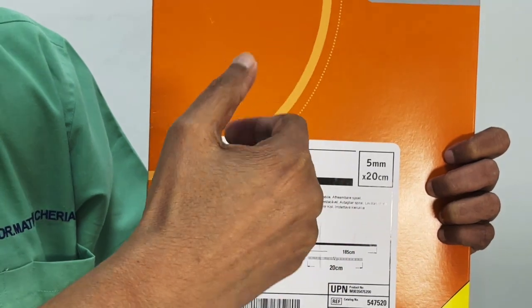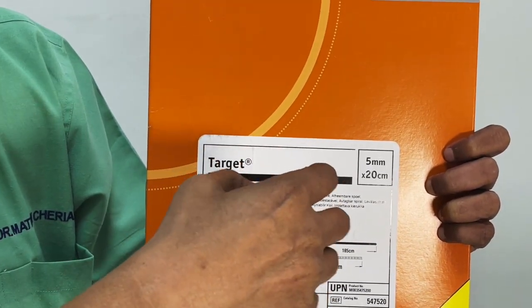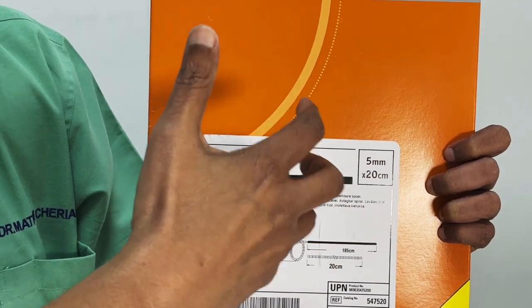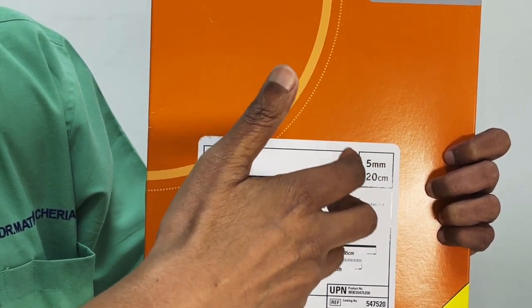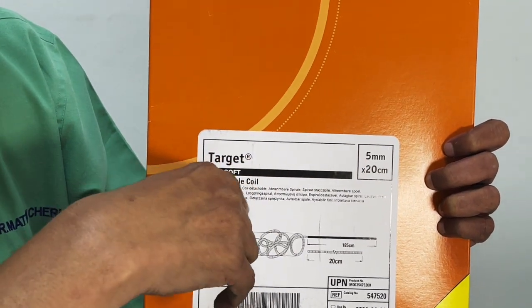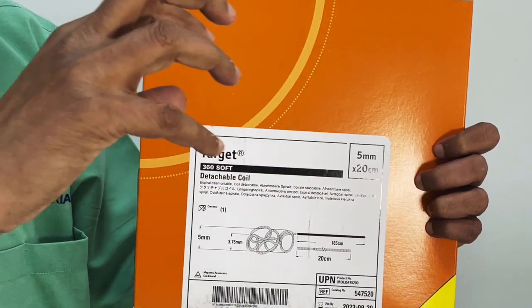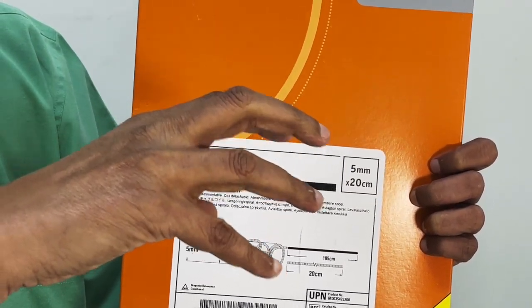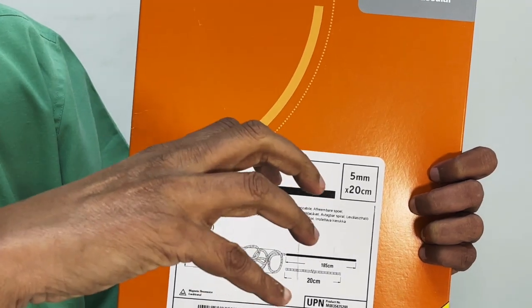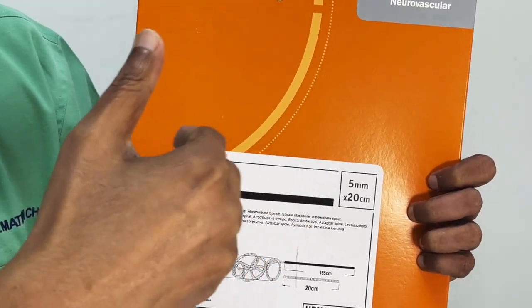So obviously, in a smaller aneurysm, you'll tend to use ultra soft. In a ruptured aneurysm, you'll tend to use ultra soft. In a large aneurysm, you'll use standard. In an intermediate aneurysm which is ruptured, you may start with a soft coil. So everything has got a trade-off. In a large aneurysm, it's safer to use ultra soft also, but the problem is coil compaction is going to be more. So you have to understand that everything has a trade-off.